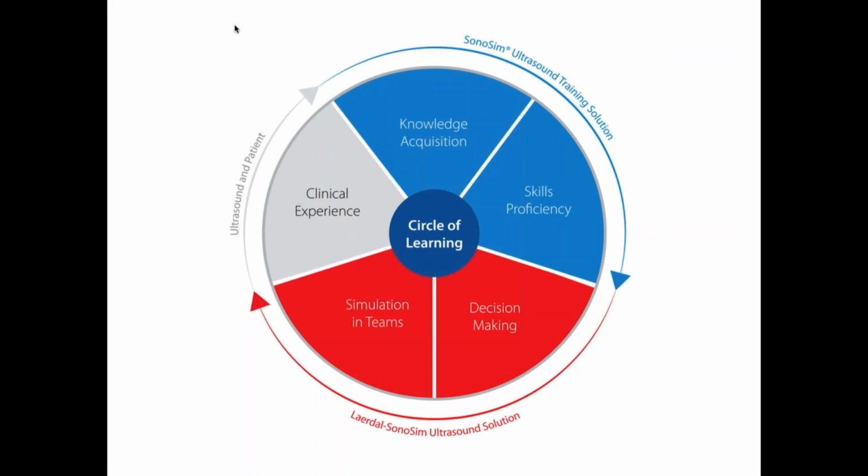Now, we're kind of going through a continuum over here. We started with the knowledge acquisition phase through the didactic sessions. We moved on to the skills proficiency through the self-directed hands-on training, and then through some of the observational assessment that we saw using the LiveScan technology. I did mention and forgot to comment about OSCEs, but we are seeing some of the medical schools integrating the ultrasound components onto standardized patients who are acting out a clinical scenario.